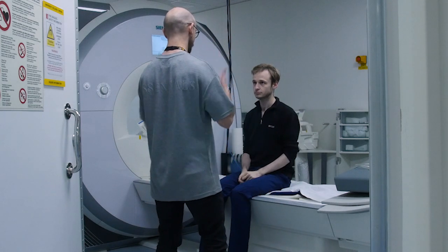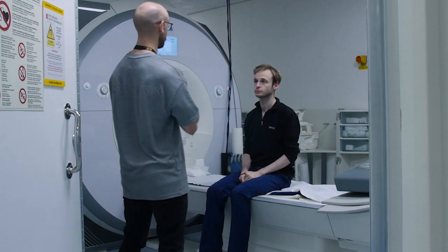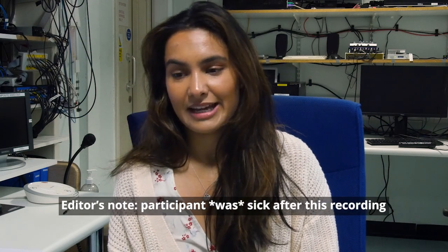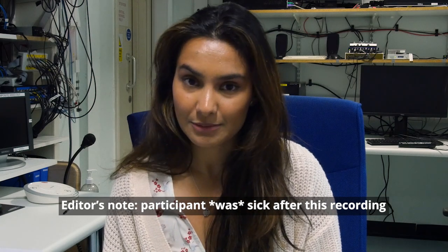they do have an uneven magnetic field, in the sense that you'll get areas of signal dropout in the basic image acquisition protocols. You need to really tweak it because it is a lot more sensitive, to see what you want to see, if that makes sense. So it's a little bit more complex than that. Also, patients and healthy volunteers report physiological issues with the scan. Sometimes, because the field strength is so high, they may feel nauseous, they may feel dizzy, they may be sick. So it has that effect on patients too, and that's something we need to take into account when running these studies.